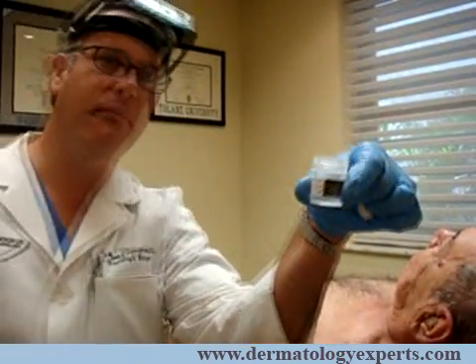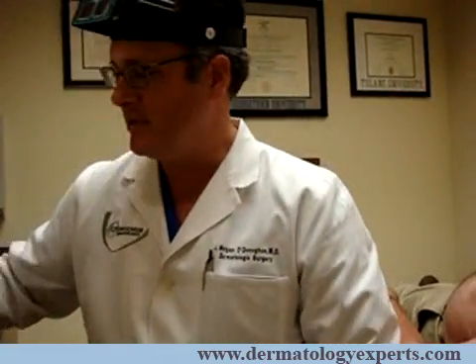And that's adequate there. Then we have a little specimen cup that I put the tissue in — it has some formaldehyde in it, which keeps that tissue preserved.